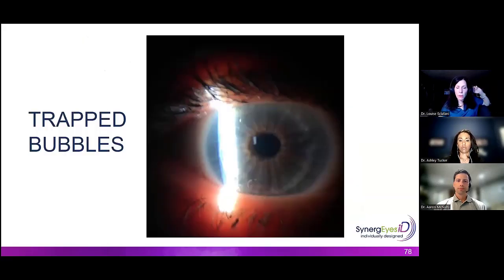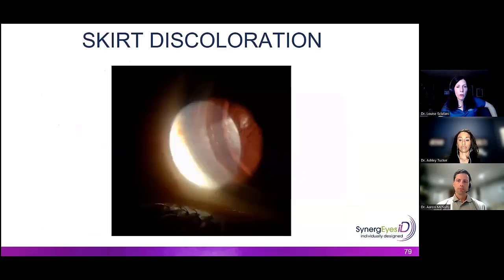Ashley showed a patient with bubbles under their skirt. That doesn't cause so much of an issue, but if you get a bubble trapped at the junction or under the GP, it's going to be uncomfortable, and it's only going to get worse throughout the day. So try to teach your patients how to look for those bubbles.